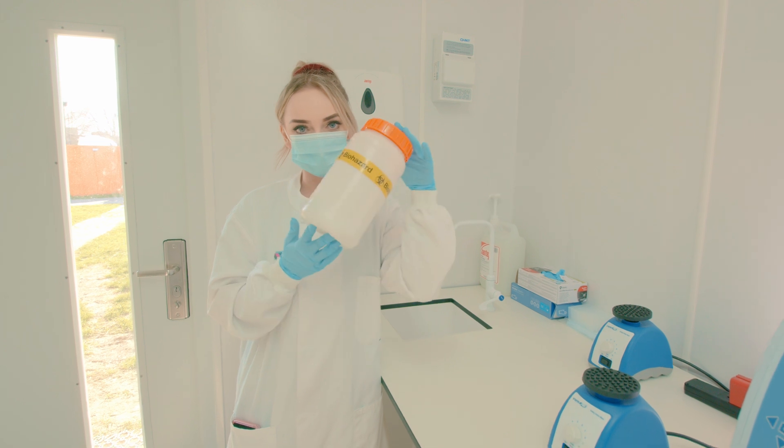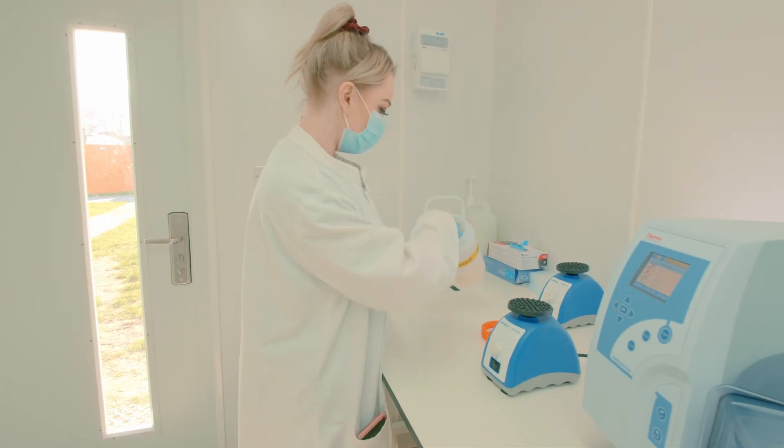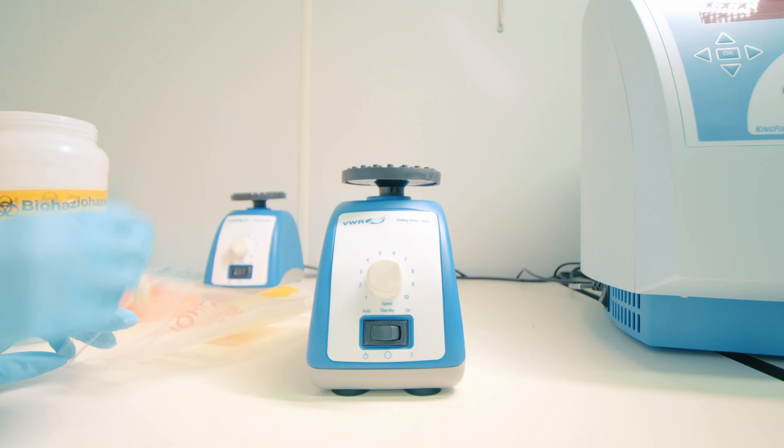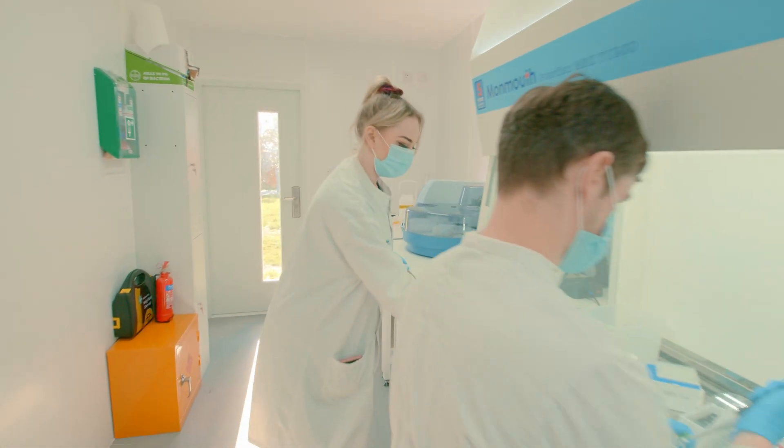We receive our samples in these biohazard bottles. We prepare them in Station A. Each sample is vortexed before we move them over to the hoods where they're prepared for extraction.